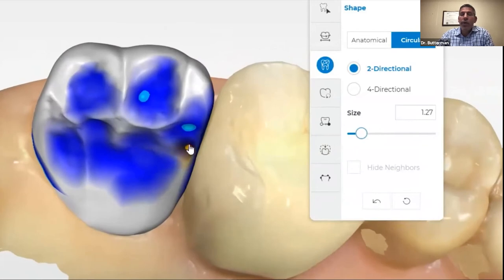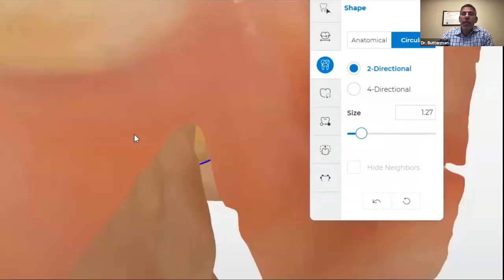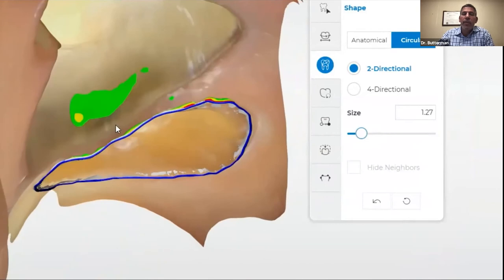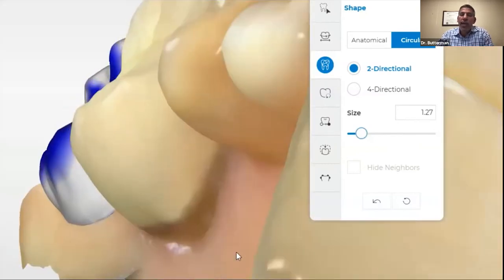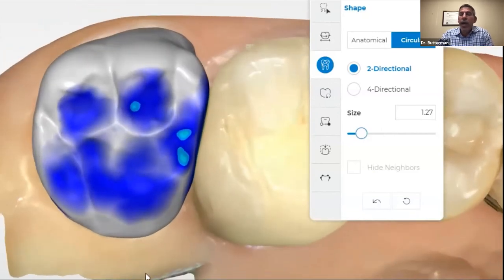The other thing you want to make sure of on a terminal tooth is that your contact is a little bit heavier. So if I normally like a little bit of green on my contact, on a terminal tooth I want to make it a little bit yellow. Make it just a little bit stronger. And those situations are going to keep that locked in. That tooth is not going to drift, and you're not going to open up that contact.